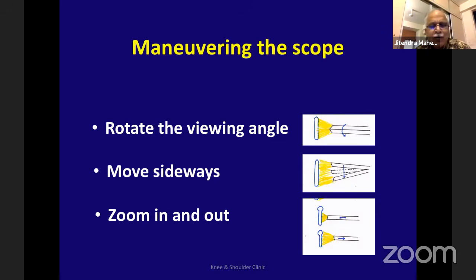But after some time, you don't know anything. You're just looking at the monitor and working. But initially, it matters. So if it is bothering you too much, you can always use a cannula. And beginners should use some kind of a system to stop bleeding water here and there because it does bother your performance. Yeah, but they should not put finger over it.